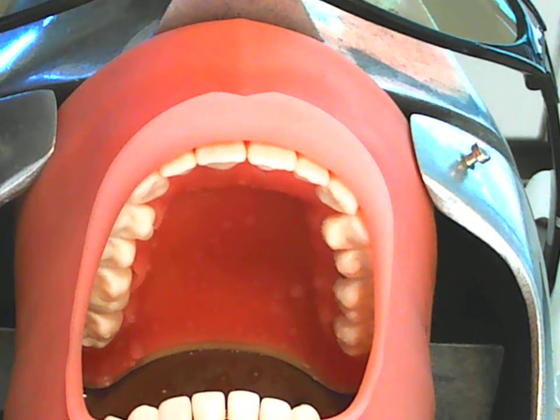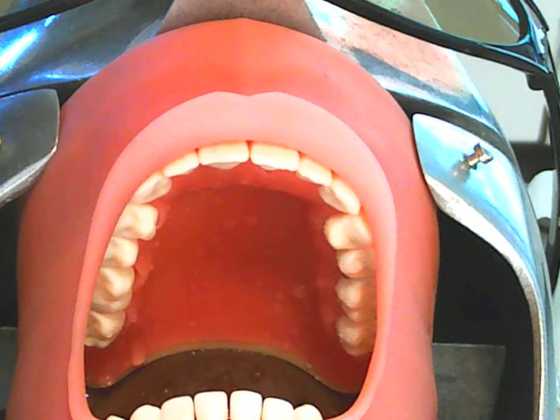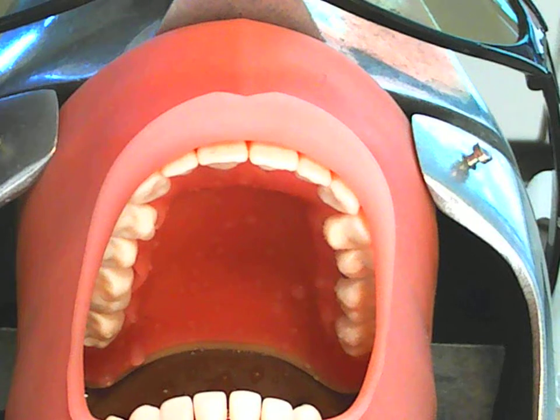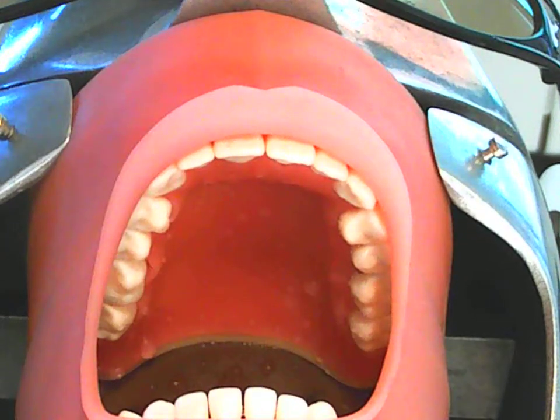I will be demonstrating the application of dental dam for an anterior incisor when the situation is for an endodontic treatment required, or a cervical class, dental dam on a single tooth, number 2-1 only today.